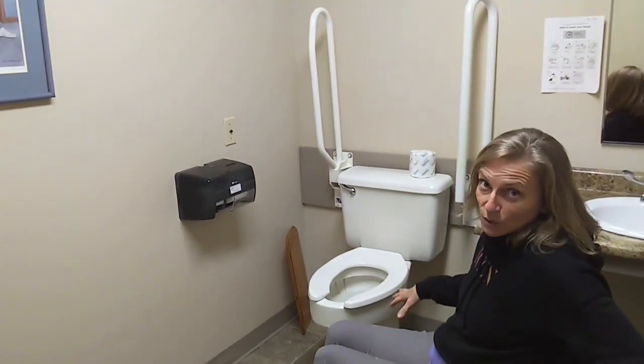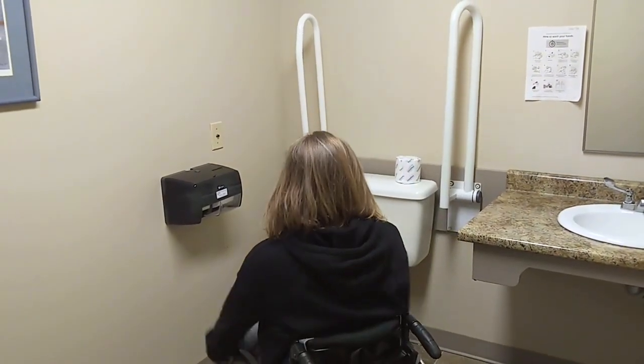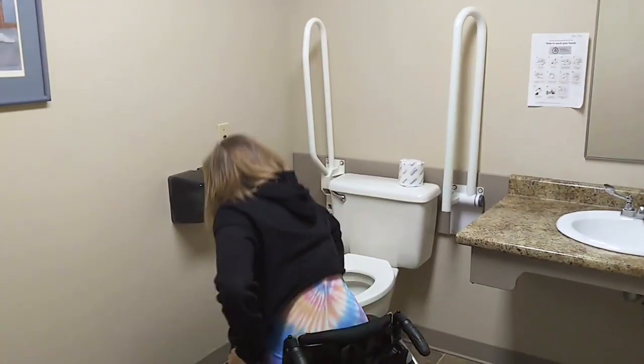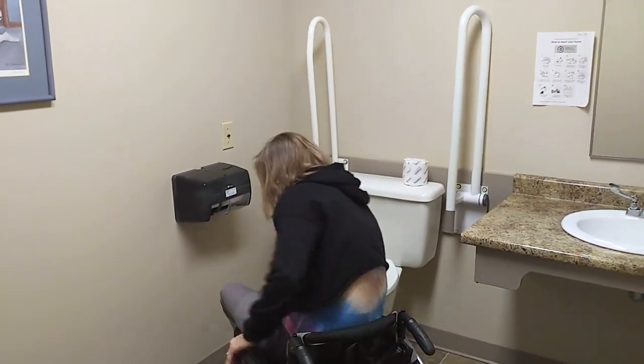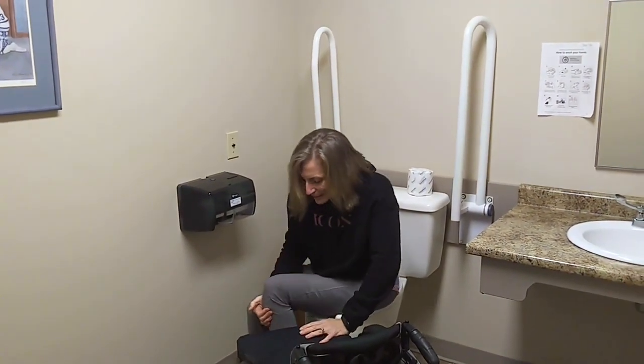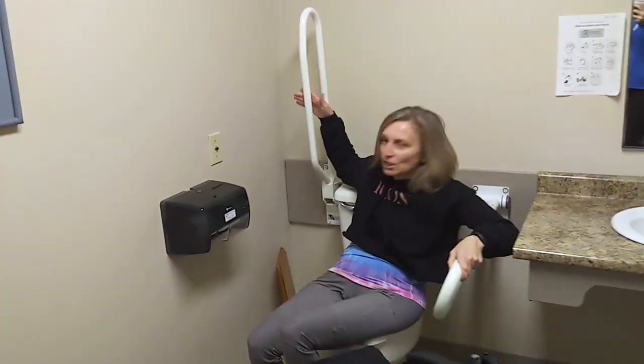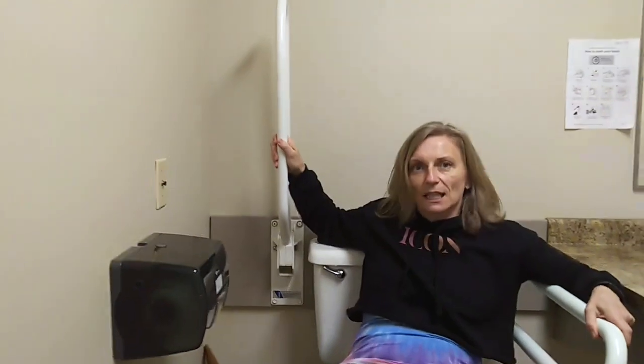I'm going to transfer onto the toilet to show you the difference between these two bars. They're often in the upright position, so I have to move them down. This one pulls down, and if I were in my chair, I would be able to reach and do that. This one actually locks in place, so I have to lift up to pull it down, which I can't do when I'm seated in my wheelchair. I don't have the reach and the strength to do that.